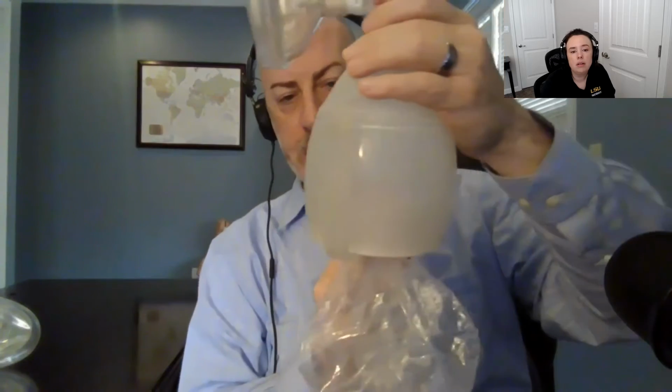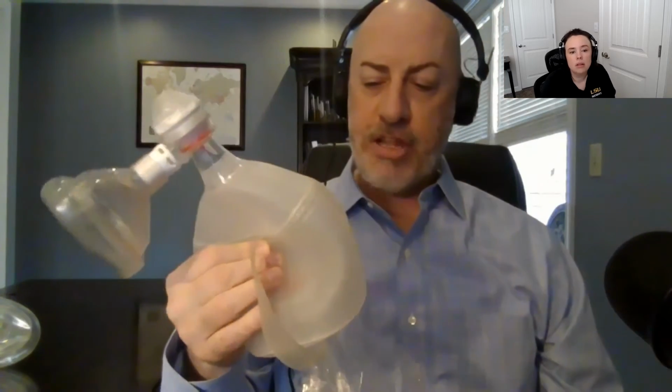So if you actually open up this first one, put the bag on, but leave this last section sleeved in, that's going to deliver about 600 mLs of air. The only issue is for most EMTs and EMS folks, they know if they come in with a BVM like this, they might get in trouble with the ER. And again, with any of these methods, you have to constantly be monitoring to make sure what you're doing is actually working for the patient. So that's the volume thing.